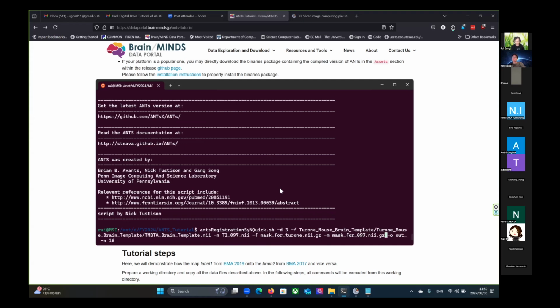Okay, thanks. So one more additional constraint, like a mask. Great. And one more question: can you calculate the regional brain volume using the warp file? Using programs like FreeSurfer, we typically want to know the brain volume difference, but probably the warp file reflects the volume difference, right?